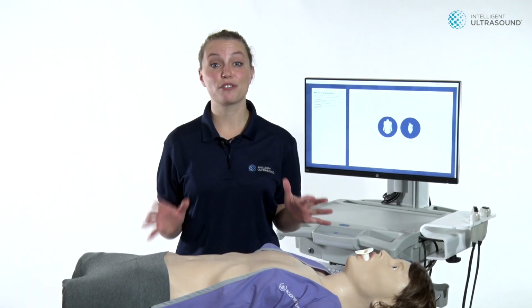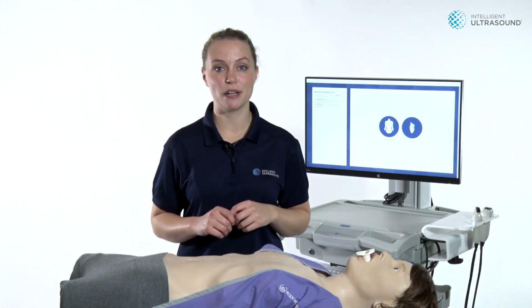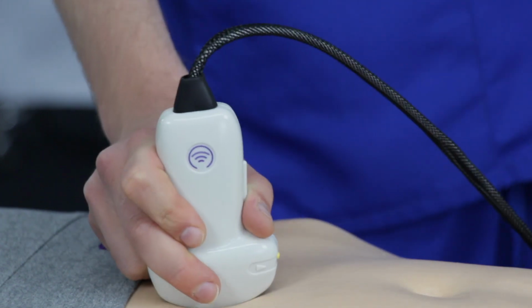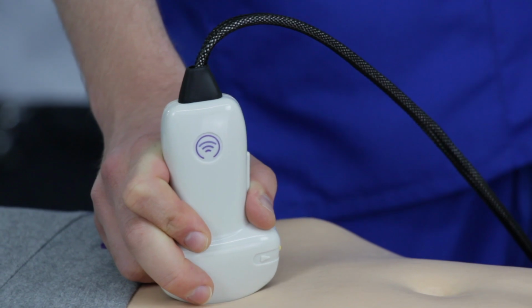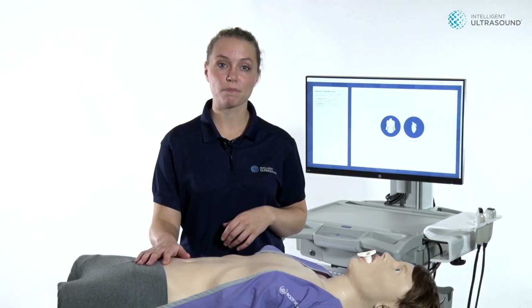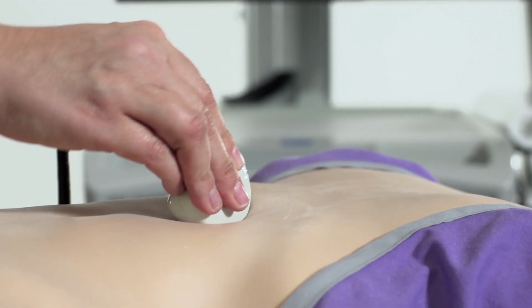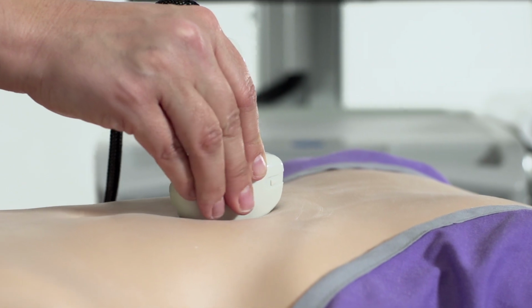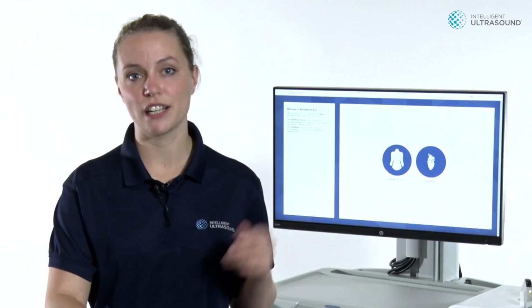Today, we are running through the features and functionality of the BodyWorks Eve PoCUS training simulator. Designed to meet the majority of the core ultrasound curriculum as defined by the International Federation of Emergency Medicine, including the OBGYN training requirements. Eve is an ultra-realistic mannequin, so trainees can learn to acquire images using the key landmarks to find the image windows and compensate for obstructions, just like in real life.